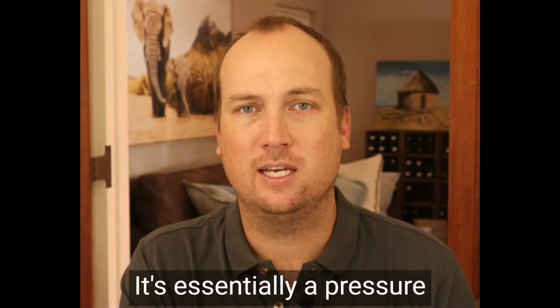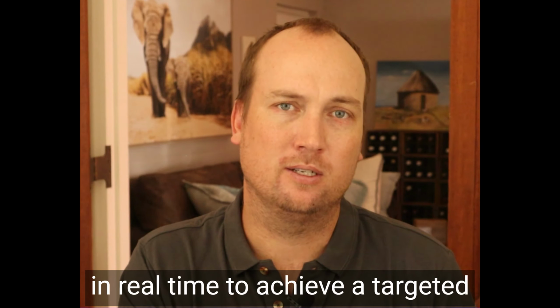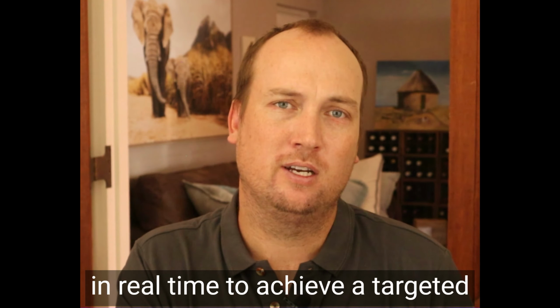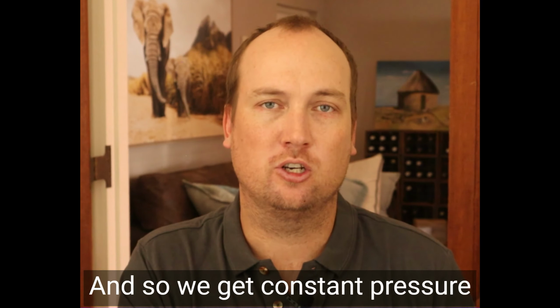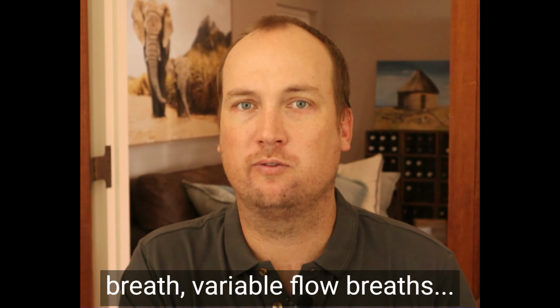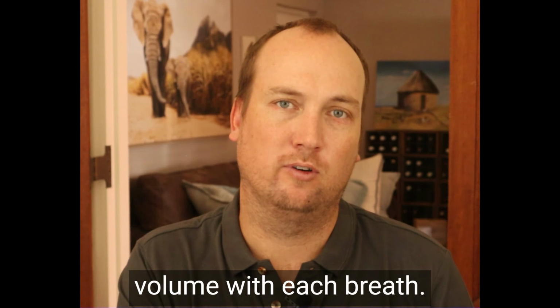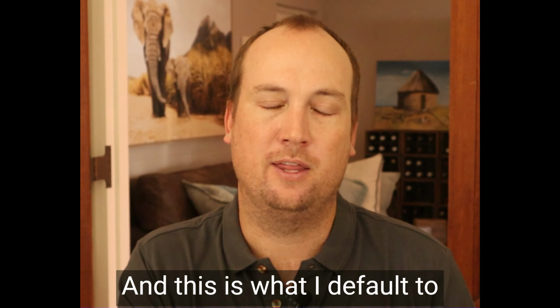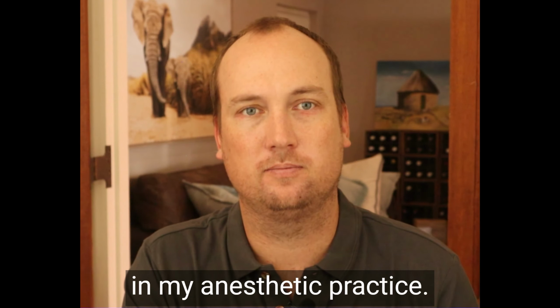It's essentially a pressure-controlled mode that is adjusting in real time to achieve a targeted volume with each breath. And so we get constant pressure breaths, variable flow breaths, but achieving a desired tidal volume with each breath. And this is what I default to in my anesthetic practice.